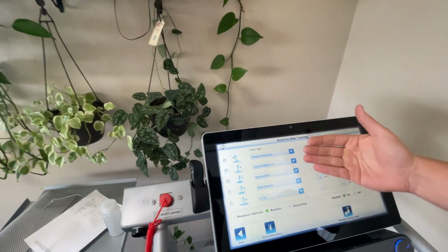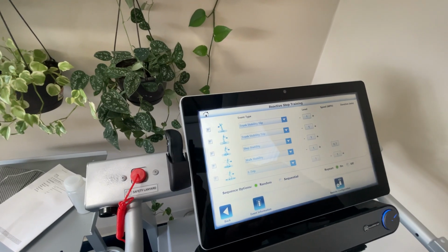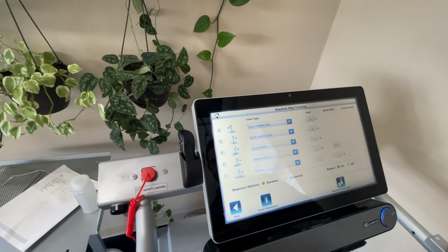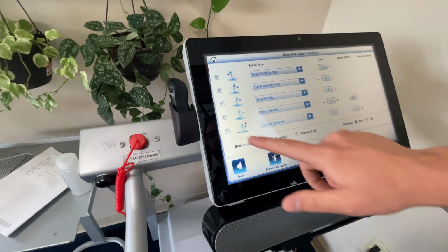So here are the 5 types of perturbations that this Reactive Step Trainer offers. We can do trunk stability, slip, trip, step, and walk stability, and then E-trip. So for today, what we're going to focus on is a trip on demand.